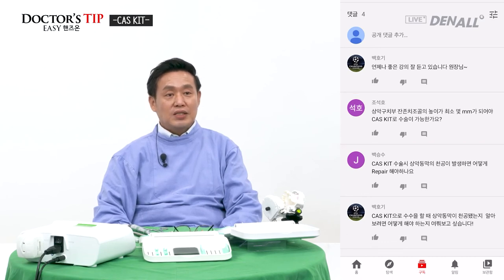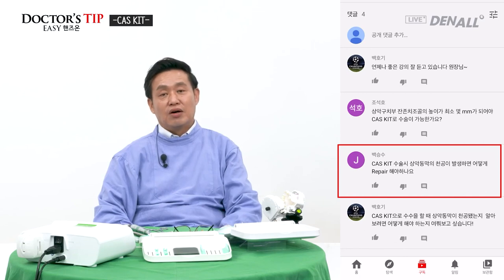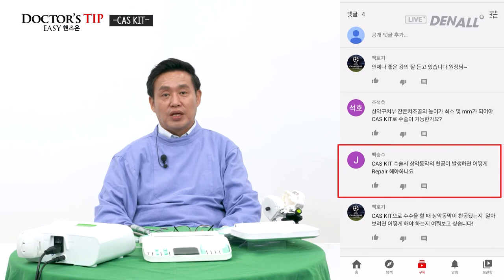Next question, during the CAS kit surgery, how can we repair the perforated membrane in the sinus? I touched upon this in the first question. During the CAS kit surgery with the hydraulic lift, if you can tell there is definitely perforation in the sinus membrane, you should not just push ahead with the surgery. There can be a risk of infection.